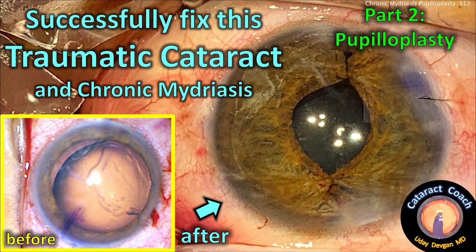CataractCoach.com successfully fixed this traumatic cataract and chronic mydriasis. Part 2: the pupilloplasty.